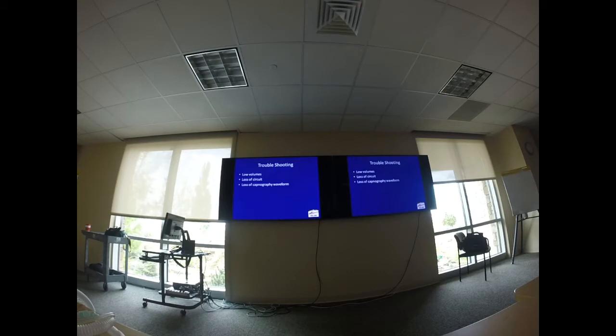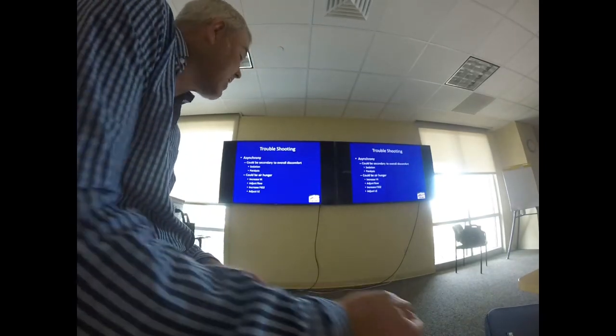So I would say that it's important to have your low volume alarm set in most cases, and I set it at 10 generally. But there's going to be other indications that your patient isn't ventilating anymore, right? Today, your end-tidal CO2 would be 0, right? You wouldn't have a waveform, which would tell you more than likely. Alright, so yeah, I agree.